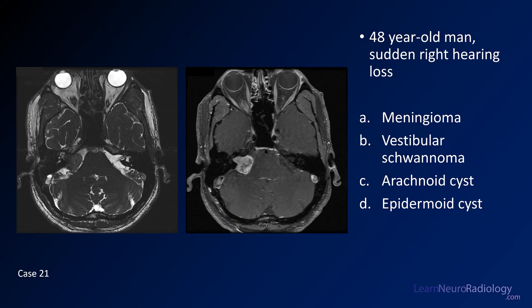Case number 21: a 48-year-old man with sudden right hearing loss. We've got a heavy T2 on the left — that's a CISS or FIESTA — and a post-contrast image on the right. Our choices are CP angle tumors: meningioma, vestibular schwannoma, arachnoid cyst, or epidermoid cyst.